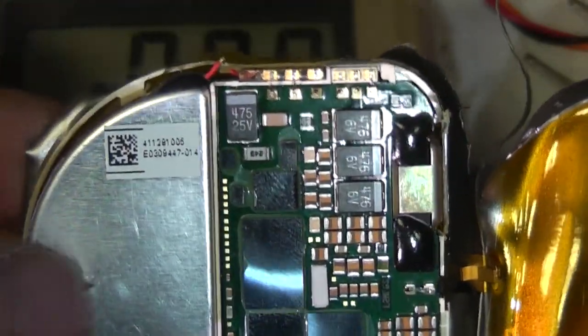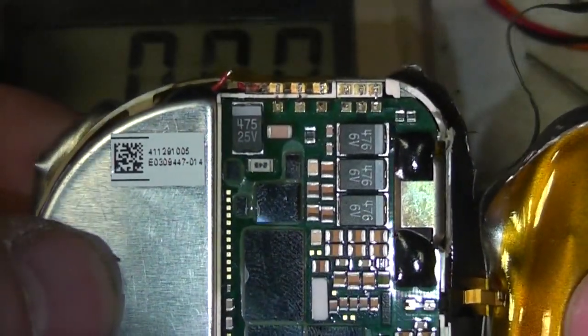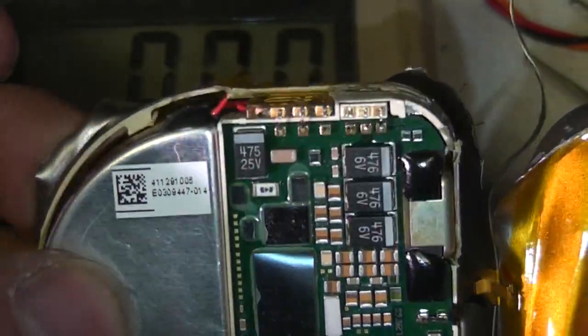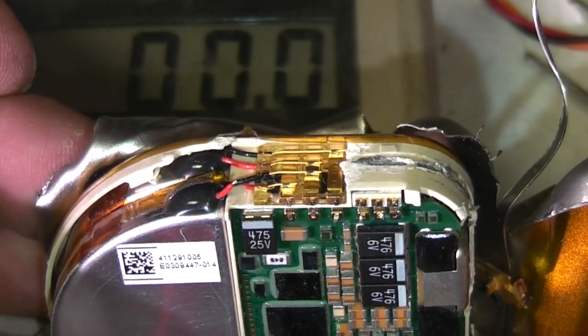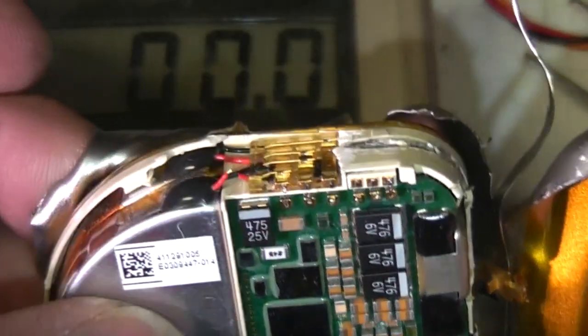Obviously an external defibrillator uses quite high voltage. It's got to get through quite a lot of skin. This thing's going to be connected pretty much directly to the heart, so I would imagine you need rather less voltage to do its thing. Not really sure what voltage that is though.